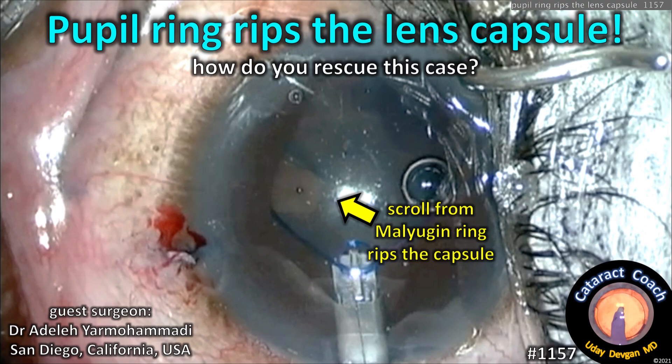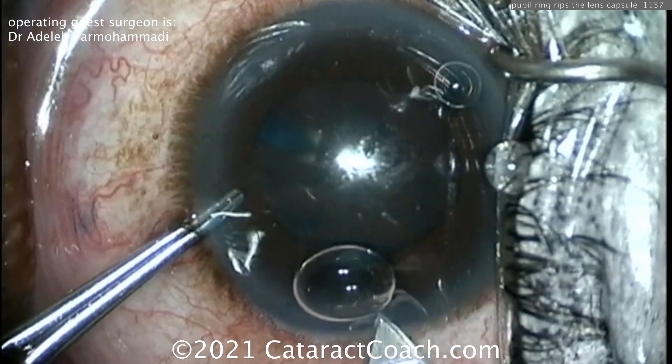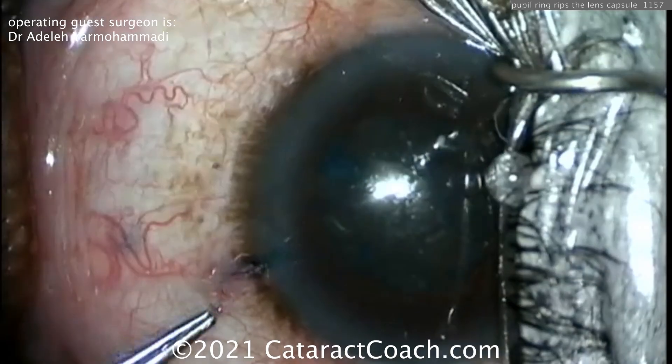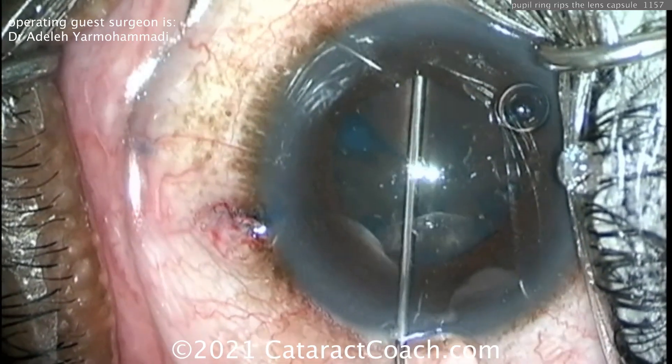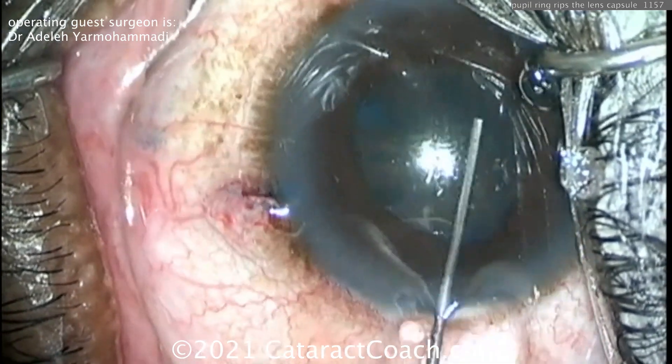Cataractcoach.com: the pupil ring rips the lens capsule — how do you rescue this case? You can see the scroll from the Malyugin ring ripping the capsule open. Our guest surgeon is Dr. Adele Yarmo Hamadi from San Diego, California, USA. This is a complication I've never seen, and the beauty of Cataract Coach is that you can learn from other people's complications.